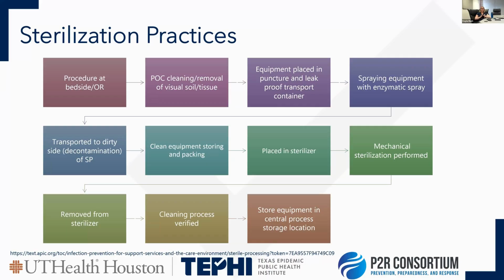place it in the sterilizer, look at afterwards how the mechanical sterilization has been performed, remove from the sterilizer, verify your cleaning process, and then where it's stored in the equipment. And we'll talk about all of these in detail.